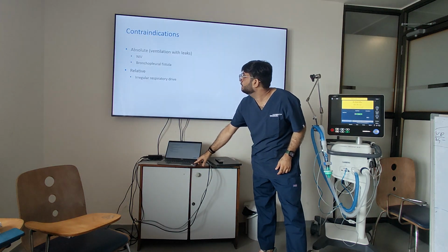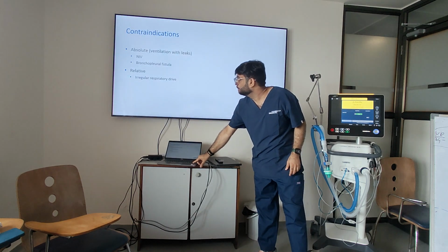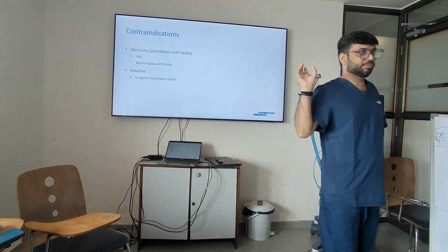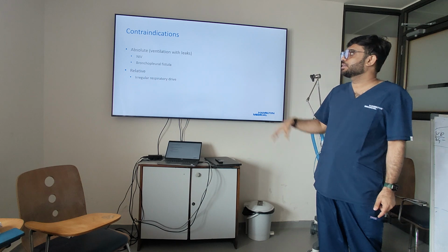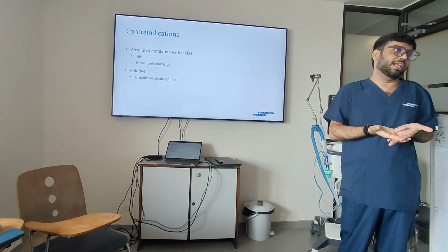Now, how to use ASV? We have already seen that. I will show you again in the vent trainer. But let's just understand the contraindications. The absolute contraindication is leaks. So that's why we don't use ASV in NIV.